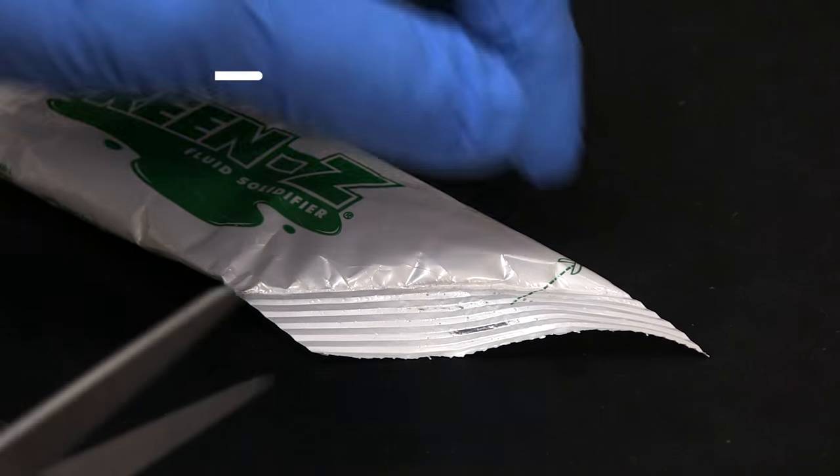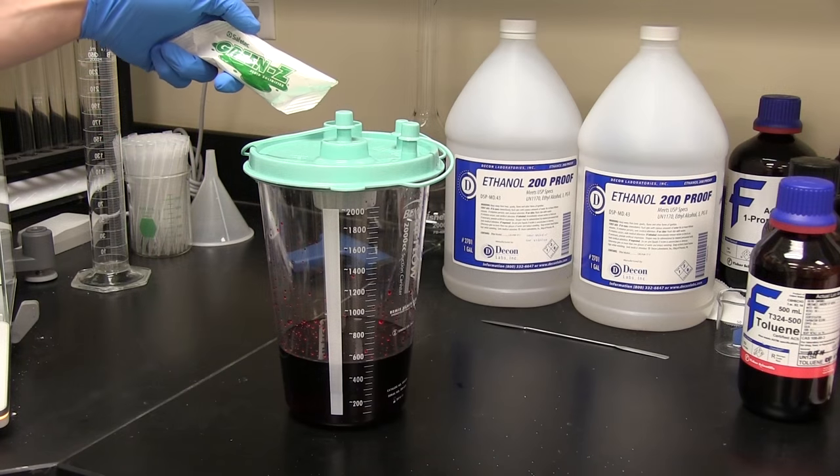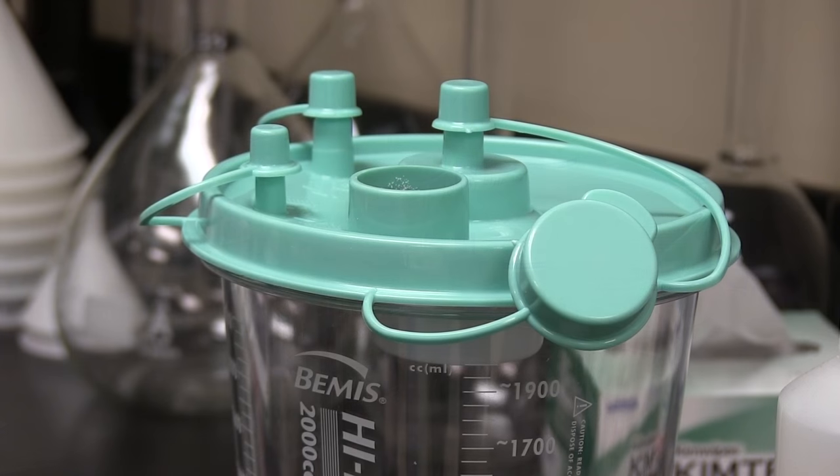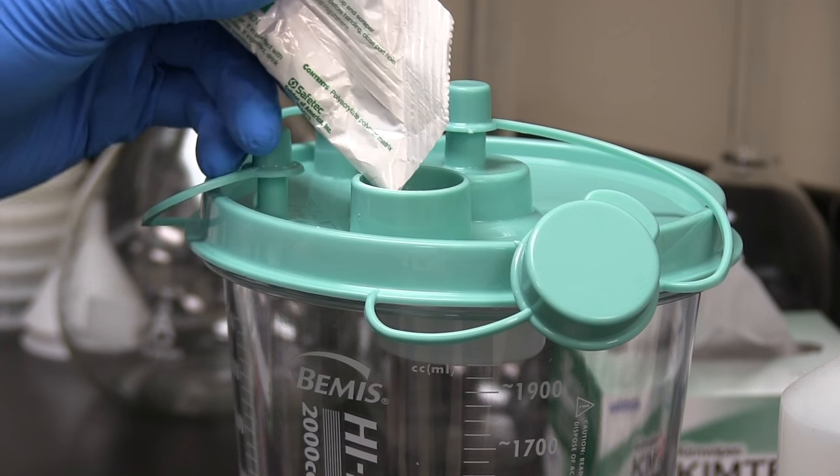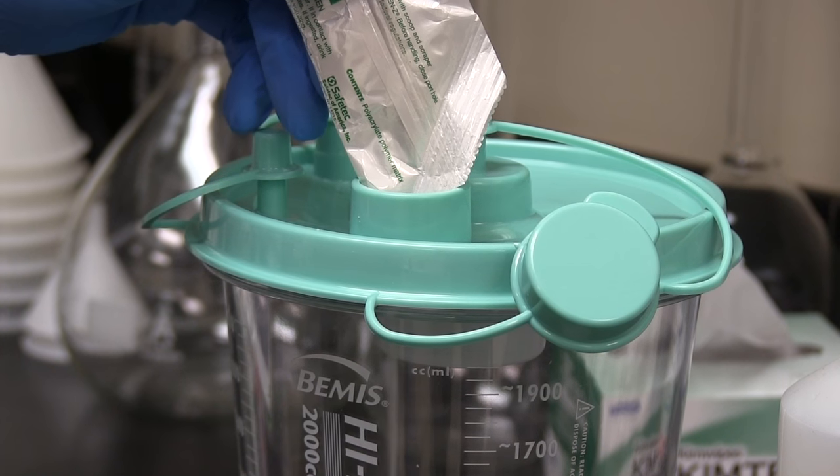For pour-in pouches, simply cut along either angled edge and enter the entire solidifier package into a canister, biohazard bag, or kick bucket. These pouches work great with an easy pour angled design and are ideal for narrow openings of suction canisters.